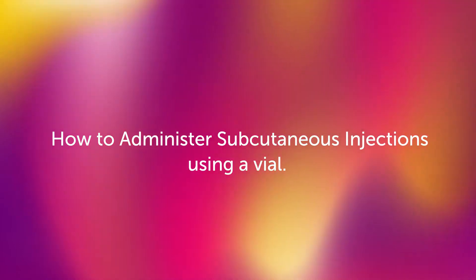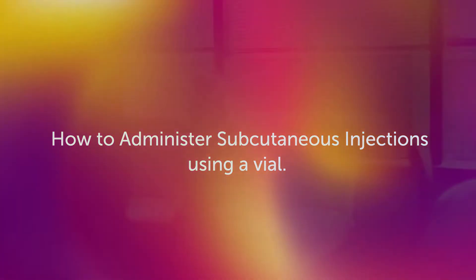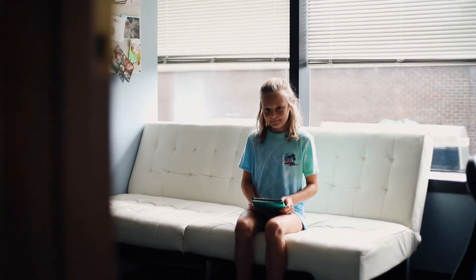How to administer subcutaneous injections. Hey kiddo, ready for your weekly shot?